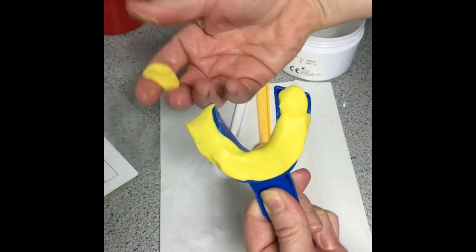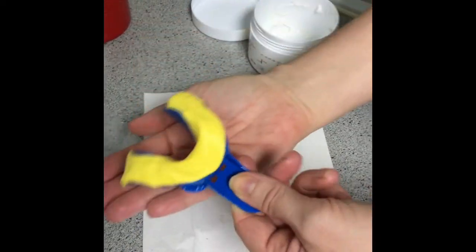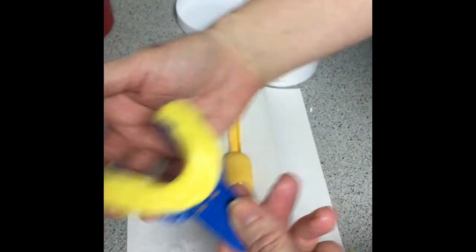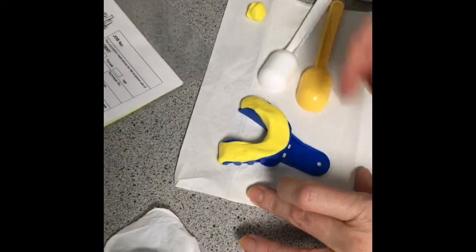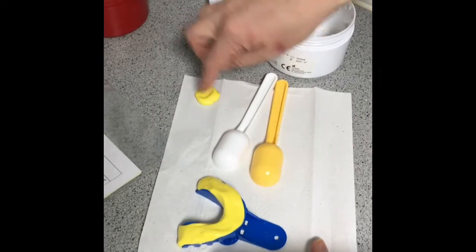You might take some excess off, which is useful because you can tell when it's set. The tray is then passed to the dentist underneath the patient's chin — to comply with health and safety, pass it around the back of the patient's head. The dentist will then use the wash impression. Keep the excess on the side and tell the dentist when it's set, as it will become hard.